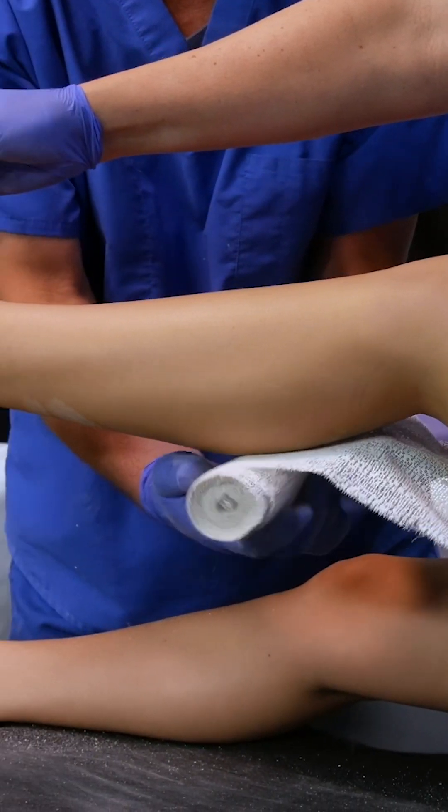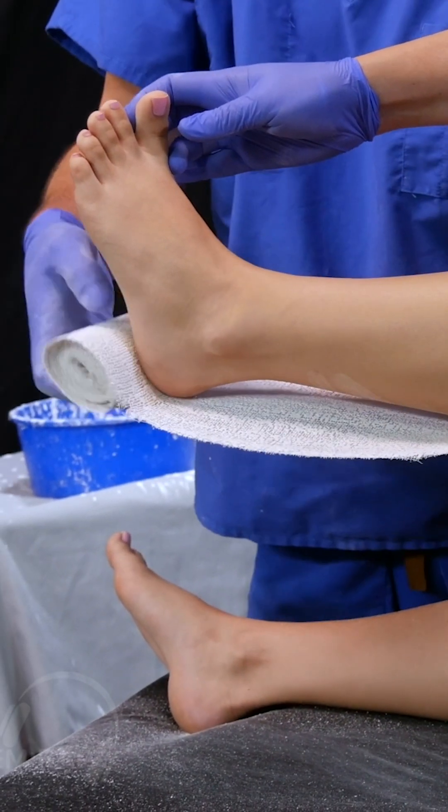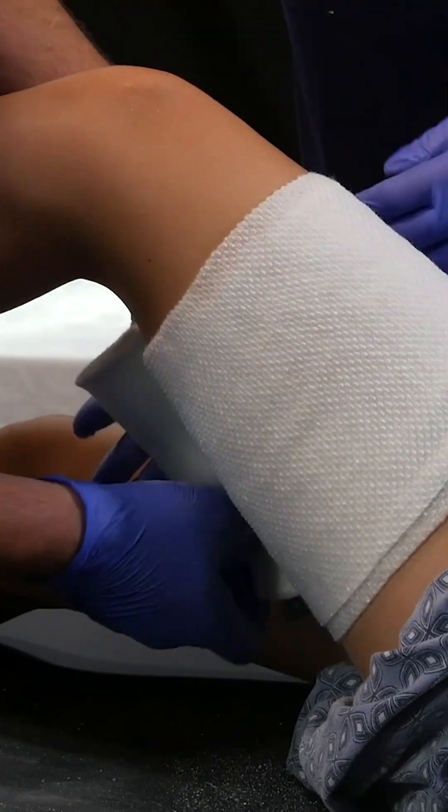When we're measuring from the buttocks crease, behind the knee, under the calcaneus, and all the way to the tip of the toes.